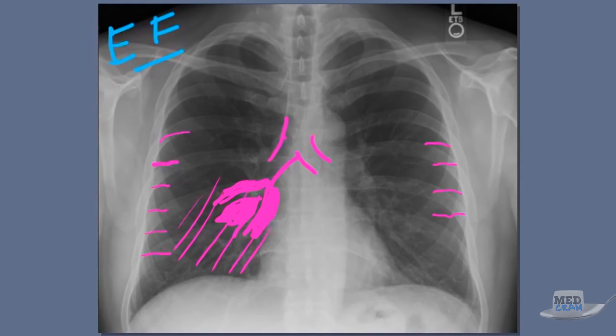So I think that completes our analysis of the normal chest x-ray. Join us for another lecture where we can look at some abnormalities and point those out to you.